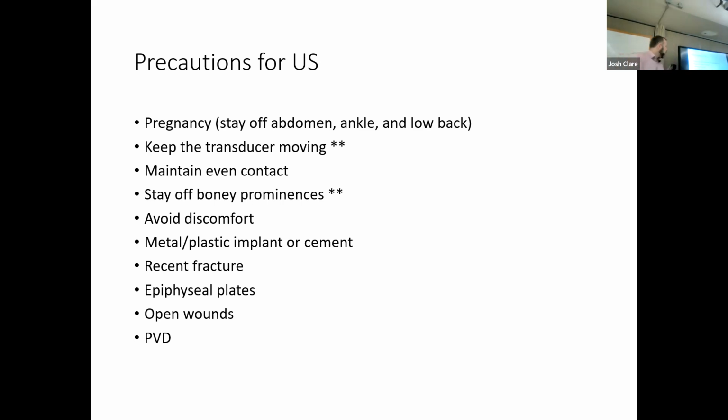Avoid discomfort, any plastic, metal, implant, or cement. That's a precaution. So I wouldn't do ultrasound over a knee replacement, right? That artificial metal and plastic, but I can do it to the gastrocs as long as I'm staying away from it. So stay away from the metal or plastic implants. Recent fractures, epiphyseal plates we've talked about, open wounds, peripheral vascular disease.